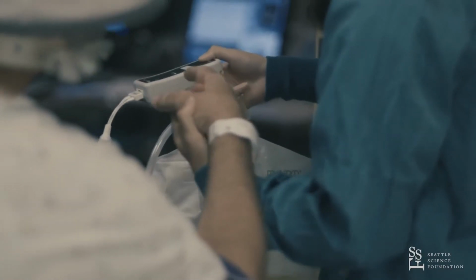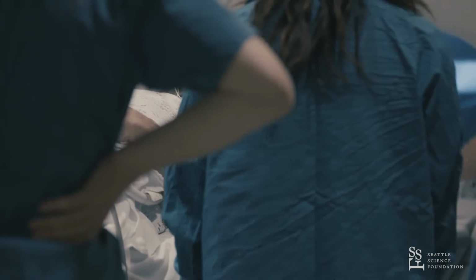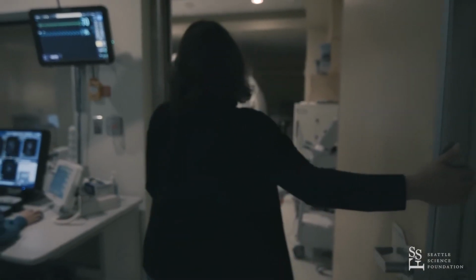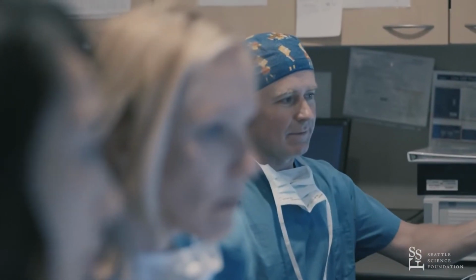Focused ultrasound is a brand new therapy where we can combine MRI technology to image what's happening inside the brain with a focused ultrasound to be able to basically raise the temperature in very small parts of the brain to deliver therapies. It's really exciting for me because, as a neurosurgeon, we're used to opening the head and going into the brain and providing our treatment. And it can be very effective, but it's very, very invasive. This technology is kind of miraculous because we can treat lesions or problems that are inside the brain without ever going into the brain physically.